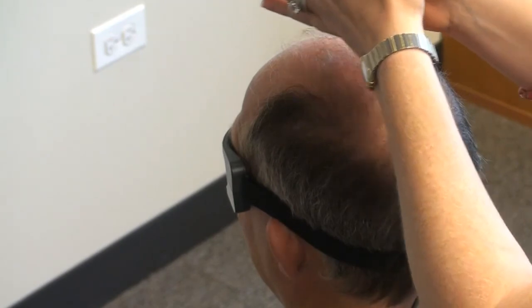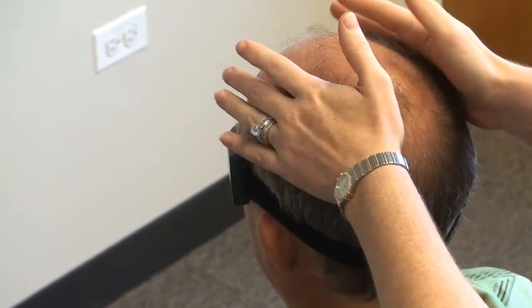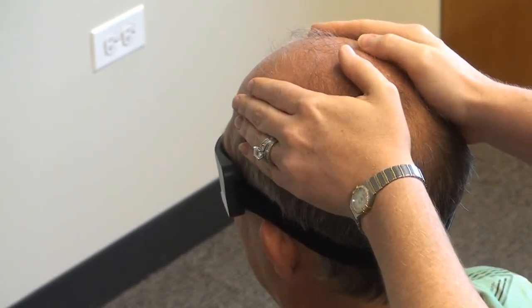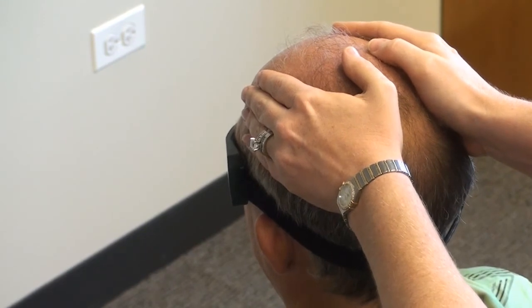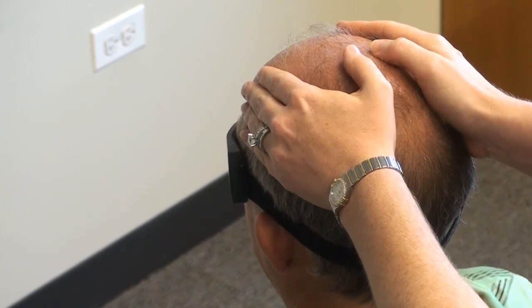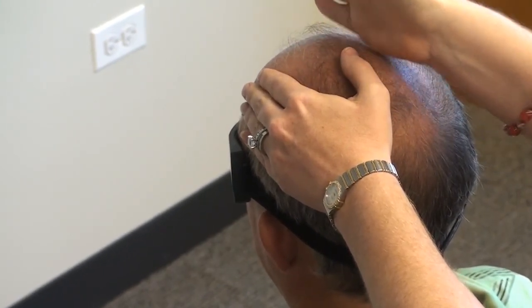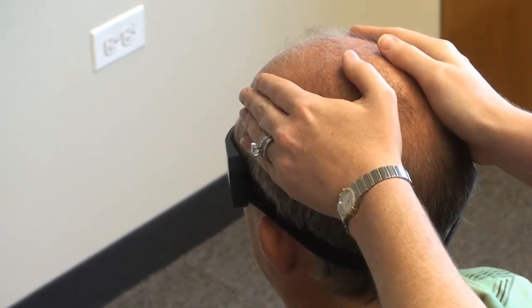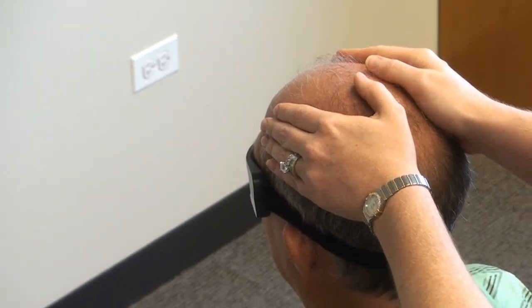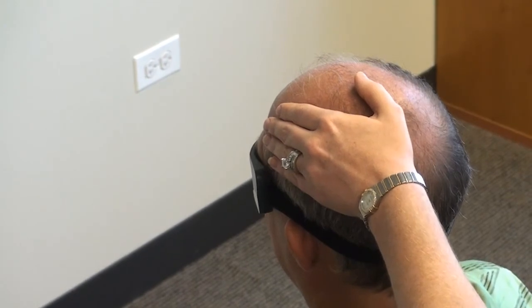If you think about it, it's like rolling a pencil in your hand. You will push with one hand and pull with the other hand. So when you do a head impulse, hold on firm and quickly move the head. Hold it there and then move the head back to center. It is a quick, abrupt motion. Then you notice from here to here is not much of an amplitude. It does not have to be a very big amplitude. Even with this very small amplitude, the cameras are more sensitive than the naked eye and can pick up an overt or covert catch-up saccade with a small 10 degree or 20 degree amplitude.